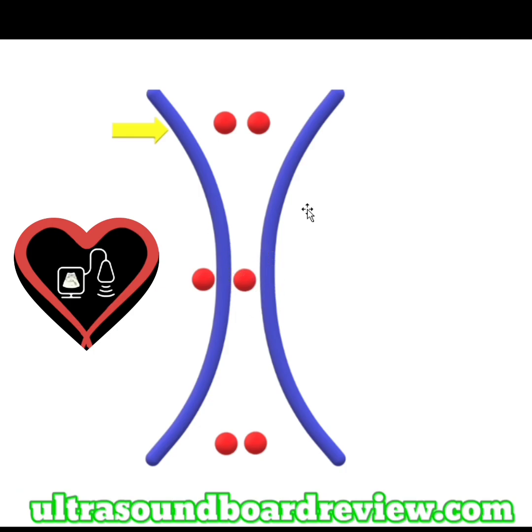What you need to know, especially for your boards, is that when ultrasound exits the transducer, or when it transmits, we call it the transmission of ultrasound, it will converge. It first converges to a single point. Once it converges to a single point, called the focus, which is the narrowest point of the beam, then it will start to diverge. When it converges to a single point, this is talking about the near field. The near field, or the Fresnel zone, will converge to a single point. When it diverges, we're talking about the far field, or the Fraunhofer zone. So first converges, then it diverges.